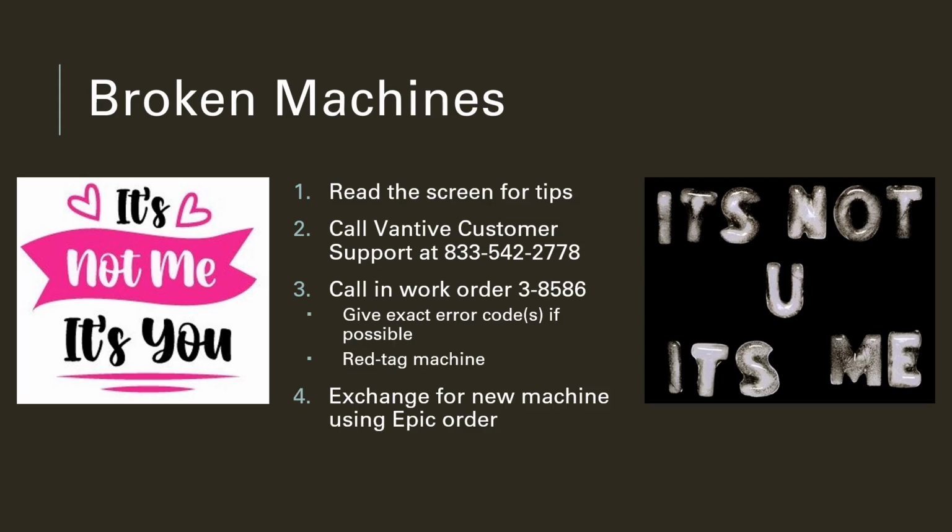For example, there's an error code that usually starts with the letter T, and it's pretty small letters, but those will greatly enhance the ability for anybody on the Vantive customer support to help troubleshoot the issue. Nurses may ask you to call the Vantive customer support on their behalf, and their number is here. However, I think it's probably better for the nurse themselves to call them, because Vantive is probably going to ask them to press buttons on the machine and do things that you won't really be able to do remotely.